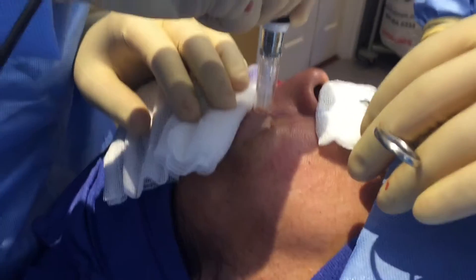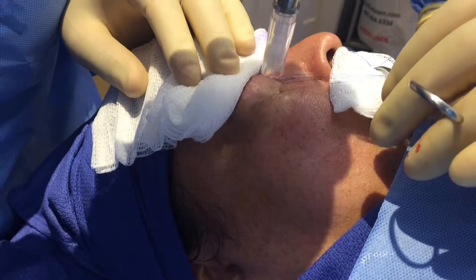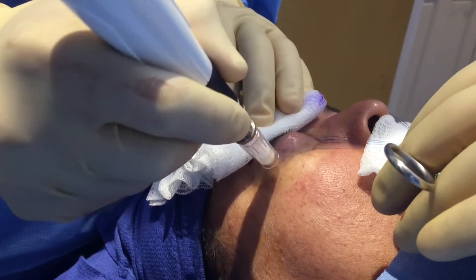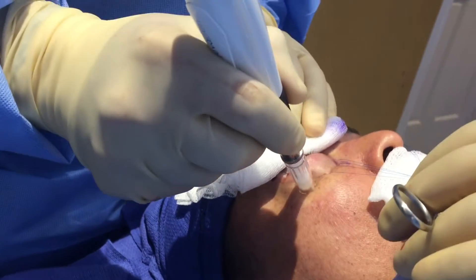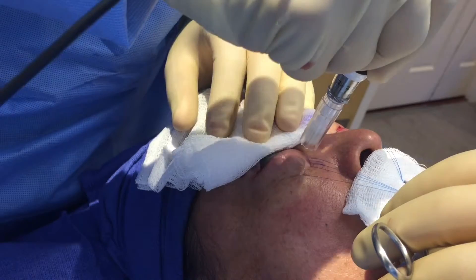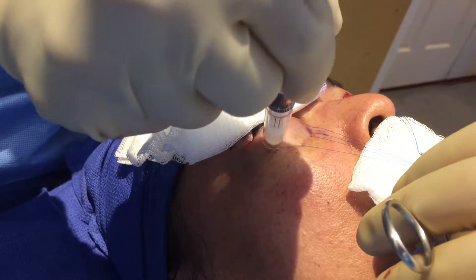Here we're doing micro needling for the lower lid. Patients that are not good candidates for laser resurfacing or chemical peel because they have hyperpigmentation can have micro needling done at the end of a blepharoplasty to help improve the collagen and tighten their lower lid.